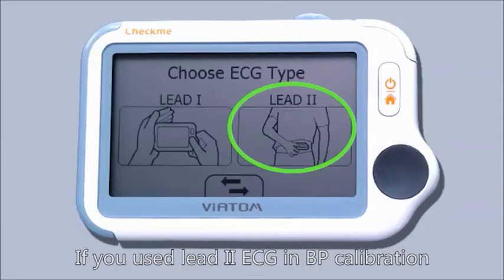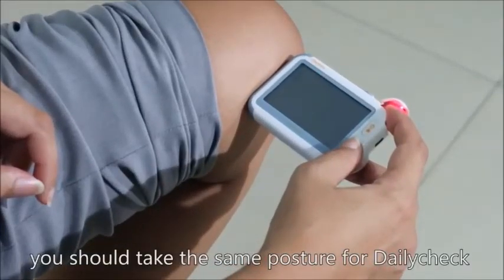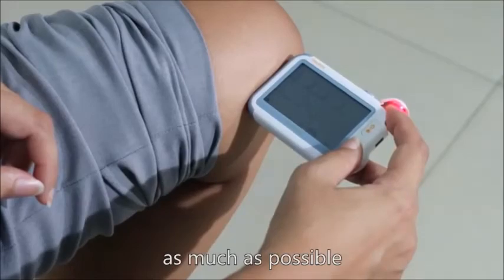If you use lead-2 ECG in BP calibration, you should take the same posture for daily check as much as possible.